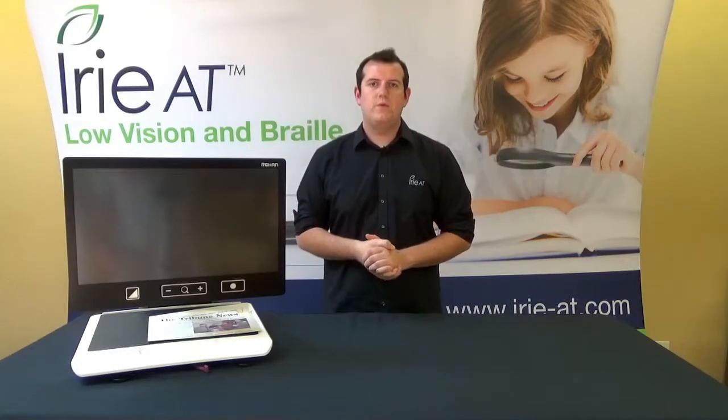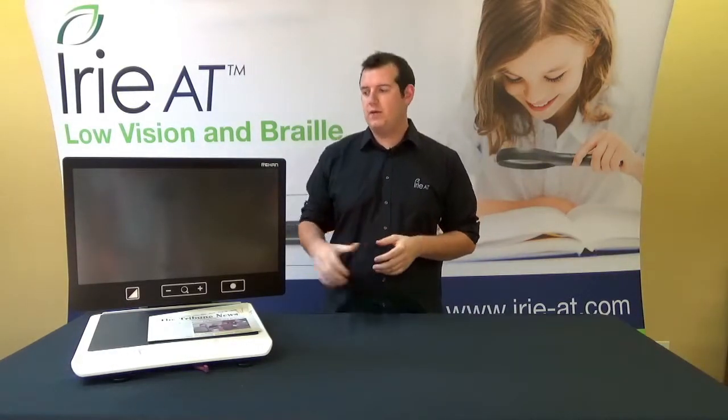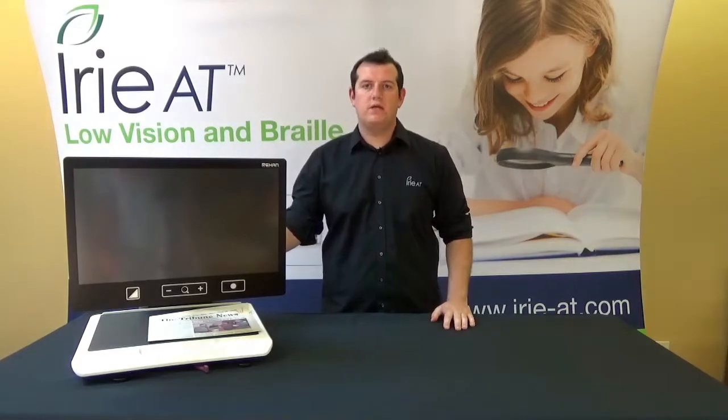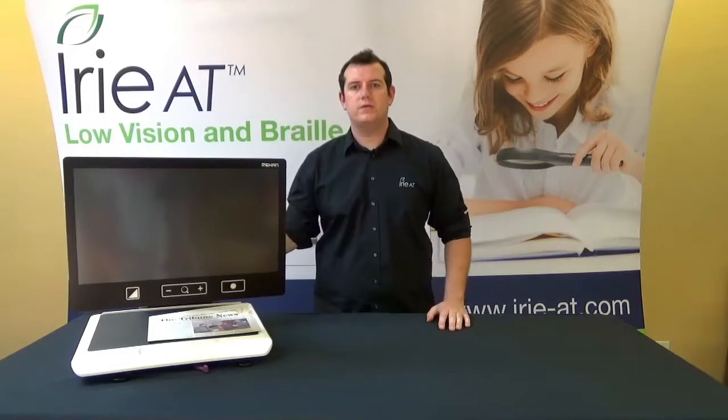Welcome everybody to another episode of John's Demo Room. I'm John with Irie AT and today we're going to be taking a look at a desktop CCTV. This time it is the Acuity Speech from Rehan Electronics. So without further ado let's go ahead and dive down and take a closer look.